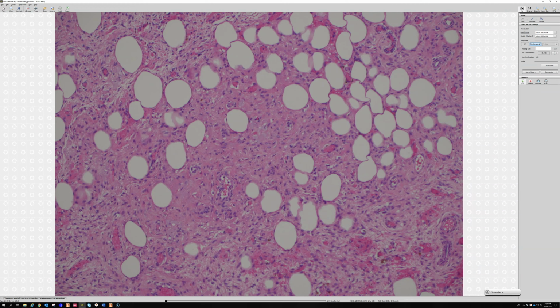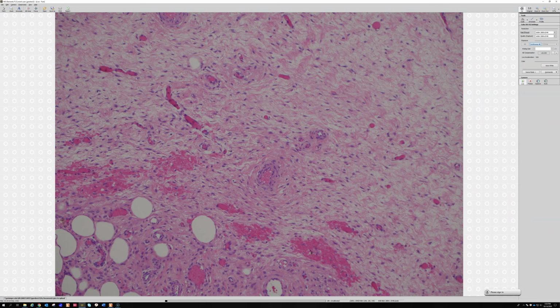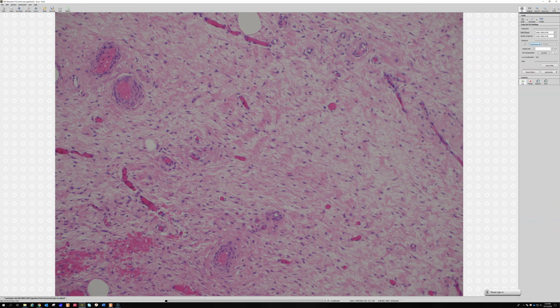So these are quite rare, and the one thing that helps me a lot is you can see other things with a similar appearance, like fibroepithelial stromal polyps of the vulva. Sometimes you can see areas that look a little like this in angiomyofibroblastoma of the vulva. I feel like all of those stromal tumors that occur in the female genital tract have some overlapping features. The biggest thing that helps me here is these are big, deep tumors. So if you have a small polyp on the vulva, on the labia, with no mass underneath it, it's not this. These are going to be large, deep masses usually.